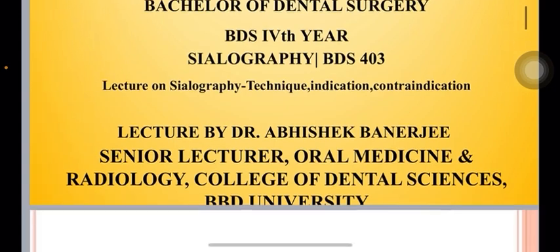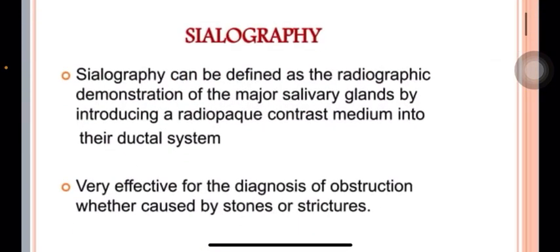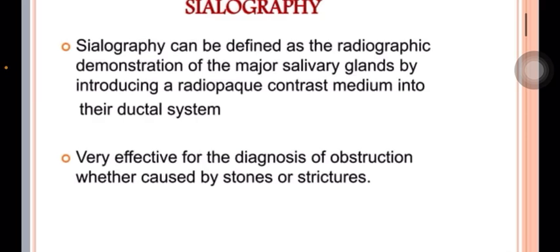Sialography can be defined as a radiographic demonstration of the major salivary glands by introducing a radio-opaque contrast media into the ductal system. It is very effective for diagnosis of obstruction, whether caused by a stone or strictures. Strictures means narrowing of the canal.